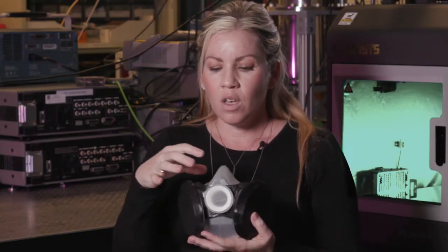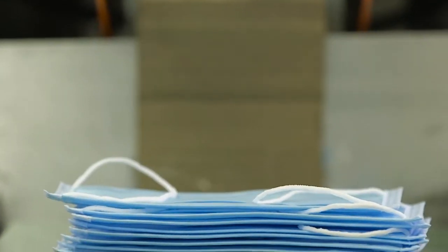If a component fails, the component itself can be replaced and the rest of the mask is still usable.